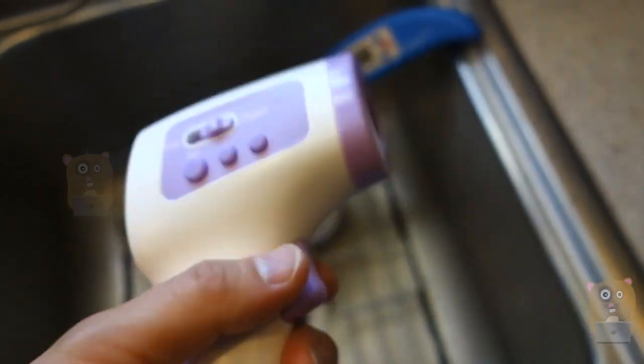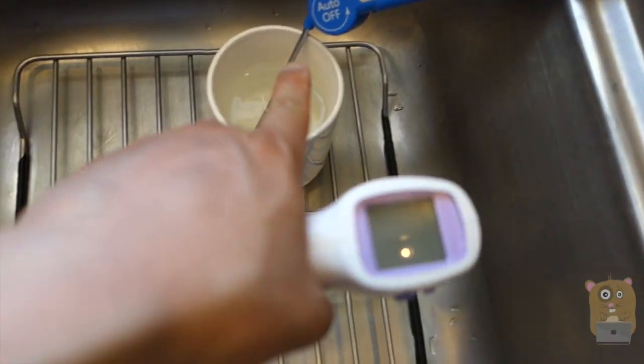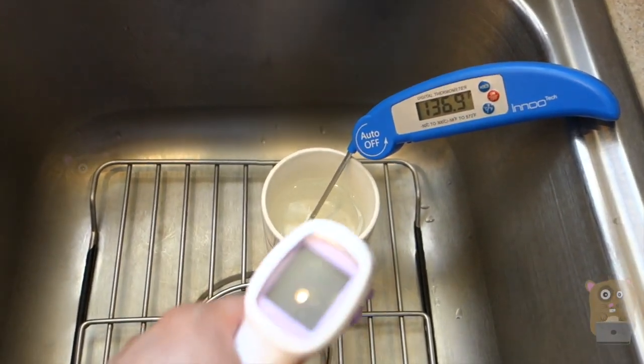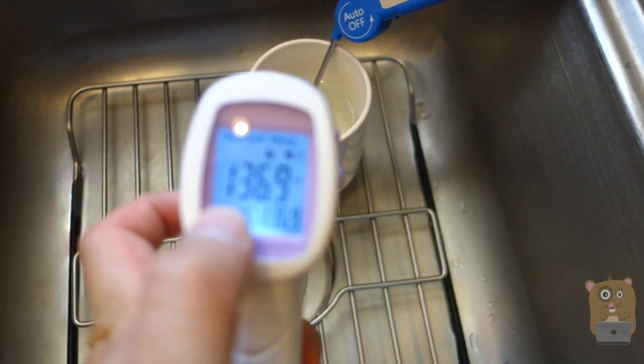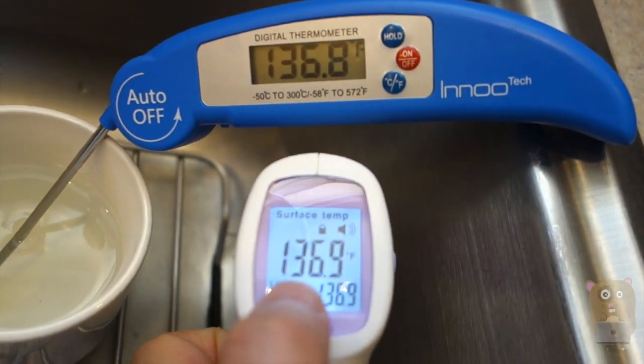If I set it to object mode, I can use it to measure cooking surfaces, surfaces of water, or anything. For example, this is hot water from my electric kettle, currently about 136 degrees Fahrenheit. I move about 1.2 to 5.9 inches away and it also reads 136 degrees Fahrenheit — same.